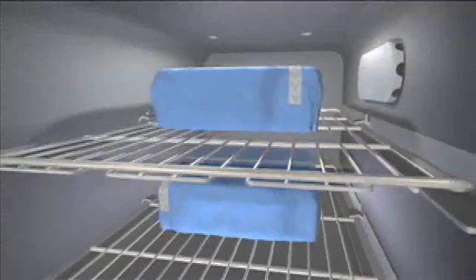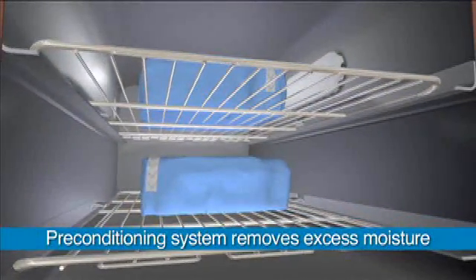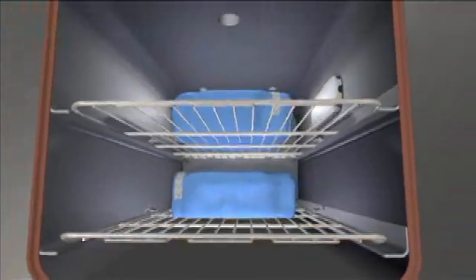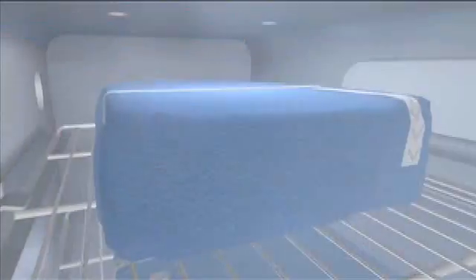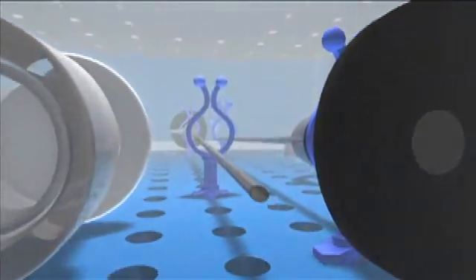Here's how it works. First, a preconditioning system automatically detects and removes any excess moisture. Next, the liquid hydrogen peroxide is turned into vapor, which fills the chamber, contacting all surfaces and penetrating hard-to-reach lumens.